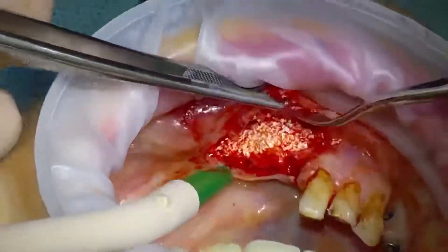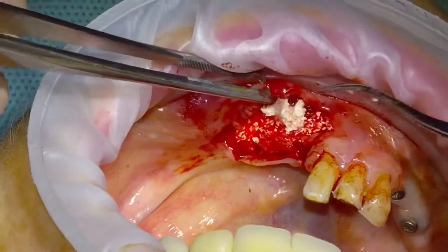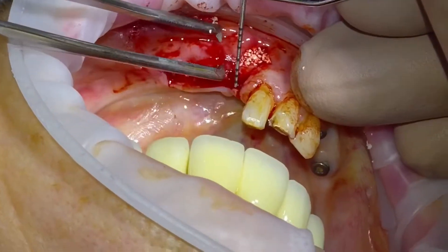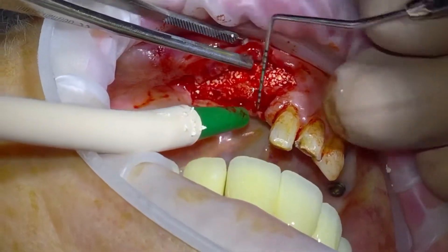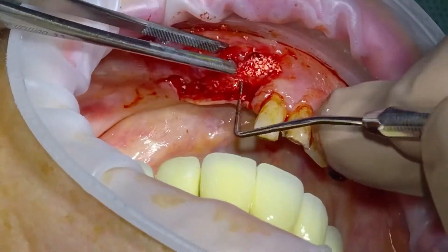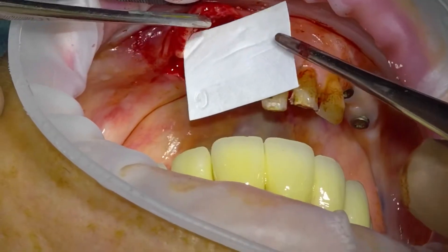I just use a very simple elevator to pack it in there. This is where it's critical that we have very good flap mobility — which is all the hard work done at the start. You can see that the flap approximates, and then I just use a perio probe graduated with millimetres to check dimensions. I'm checking that I've actually rebuilt the ridge enough for future implant placement — that's something that often gets forgotten about; we need to check that we can actually put implants into our graft.